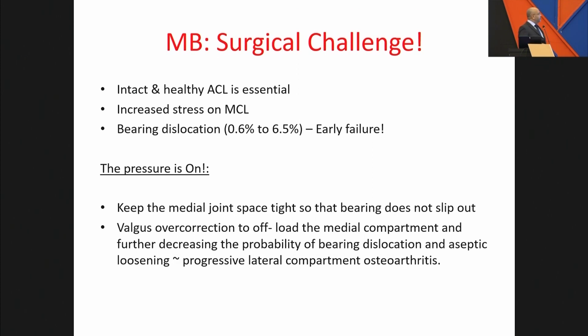So when you talk about mobile bearing, then you have the pressure of getting it all together in the right place.